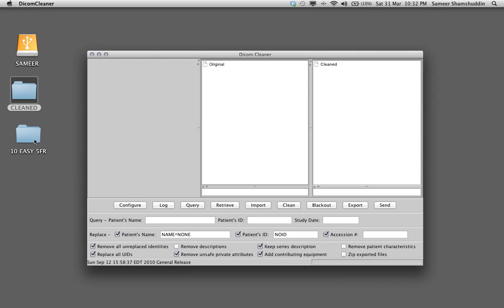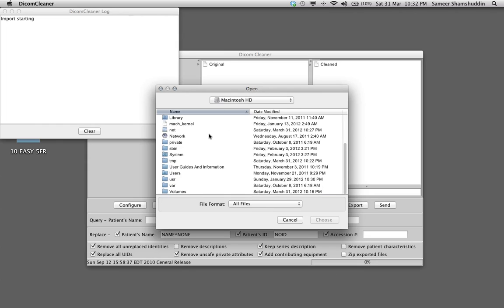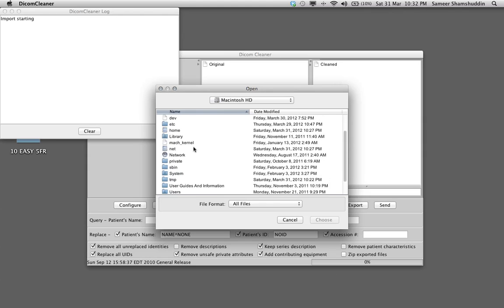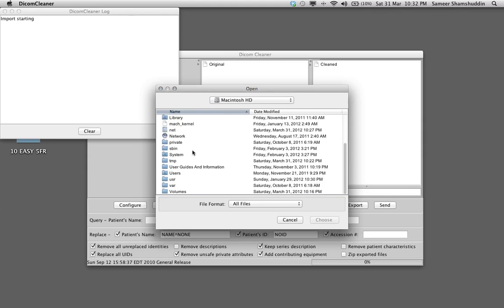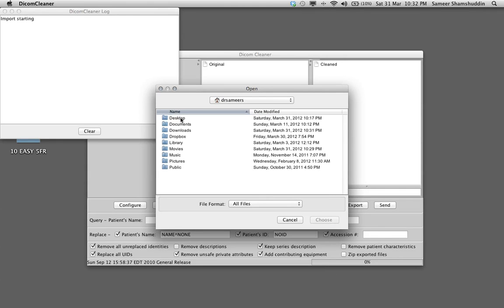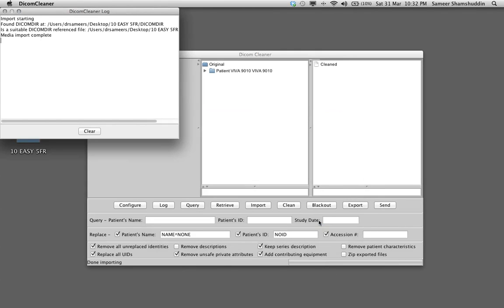So how can we clean this folder? On the DICOM Cleaner here if you click import that will pop up a window asking which case to import. If you scroll through this one click on desktop which will be under users, that's my name, desktop, 10EZ5FR and choose this file.